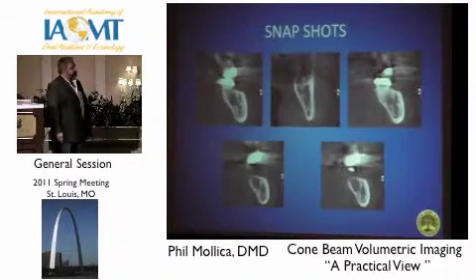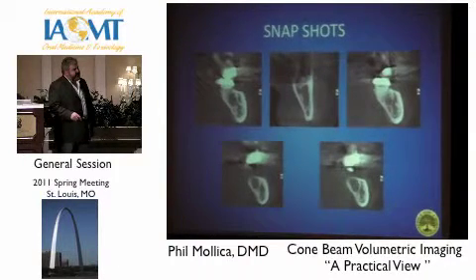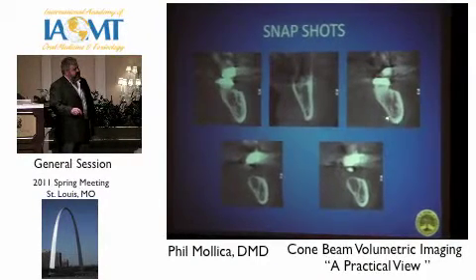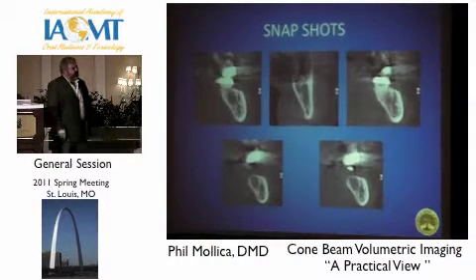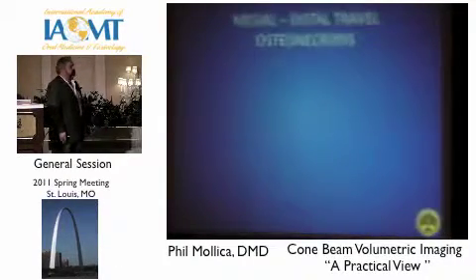To this area, we take a look, quick little snapshots. What's interesting, we're seeing these low-density areas associated with the medullary aspect of the mandibular bone itself. Cortical plate's intact, but we're seeing these weird kind of hole areas in the bone itself. Well, that's cool, but once again, let's take a little tour. Let's travel in there itself.